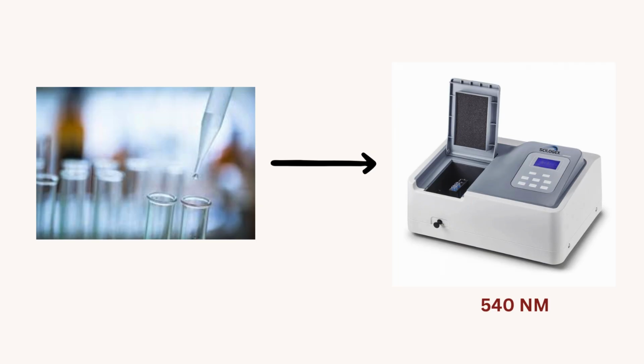When the potassium hydroxide has reached 20 degrees Celsius, add 0.1 ml of the first hemolysate to the appropriately labeled tube, at the same time starting a stopwatch. Rinse the pipette in the solution 6 to 8 times and then mix the tube well. After exactly 1 minute, add 3.4 ml of precipitating solution and thoroughly mix by capping the tube and inverting at least 6 times. Immediately filter the mixture into the appropriately labeled hemoglobin F tube.